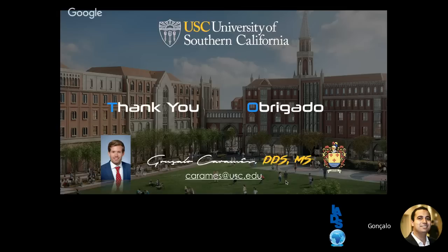That's a good question. So laser is very popular here in the US, not just for frenectomies, but for other applications. I see laser as a tool. Laser can help you in several procedures like frenectomy, and it's even used in other applications like decontamination of implants and intraosseous defects. I think you should see laser as a tool. I don't think it's better, and we don't have evidence in the literature that clearly says that laser is better.